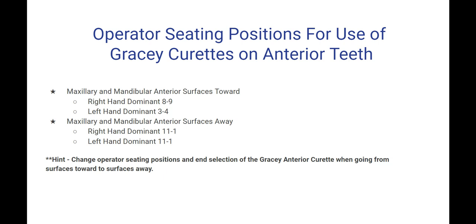You may find the 8 or 8:30 position for right hand dominant operators or the 3:30 or 4 position for left hand dominant operators works best for mandibular anterior surfaces toward. Maxillary and mandibular anterior surfaces away. Both the right hand dominant and left hand dominant operators will sit between the 11 and 1 o'clock position. Most operators choose 12 o'clock.